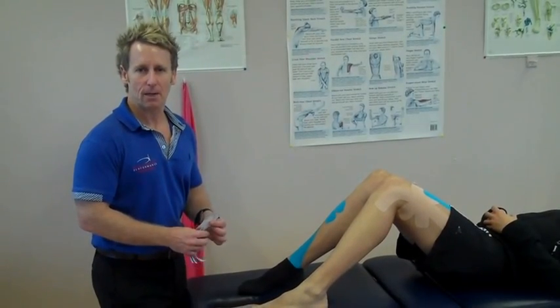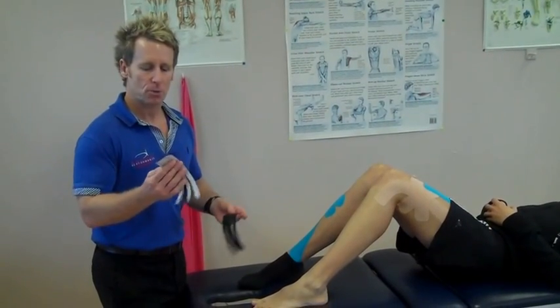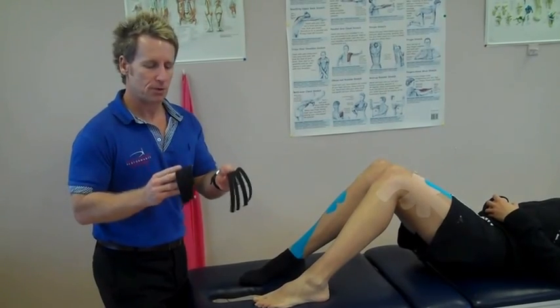Hi, my name is John Gibbons and today we're going to look at ankle edema taping using two I-strips that are formed into fan strips.